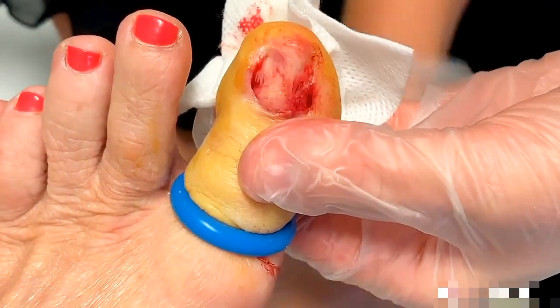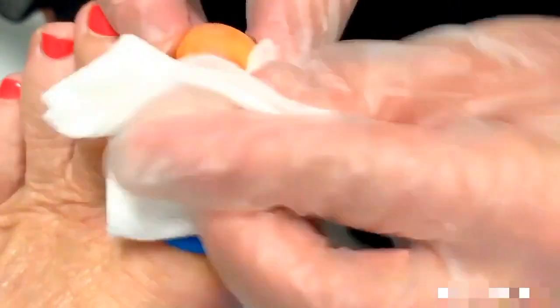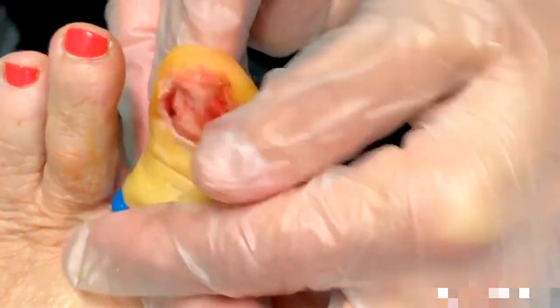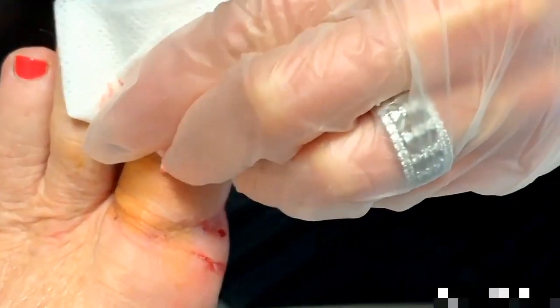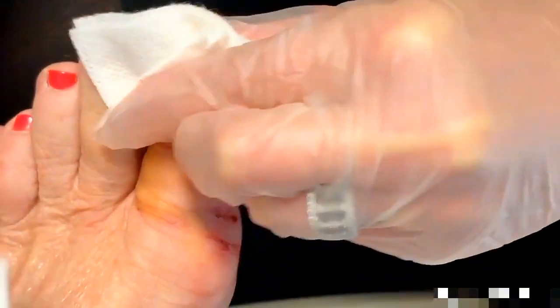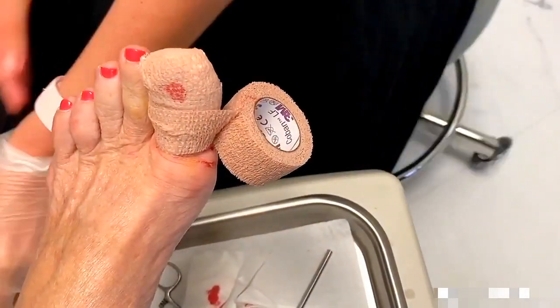In the next couple of weeks, all this is going to fill in and it's just going to look like a normal end of your toe without the toenail. And when that heals — who knows what that's supposed to look like? If you turn your thumb over, that's exactly what it looks like. You're going to be back in about two weeks and we'll get some more.